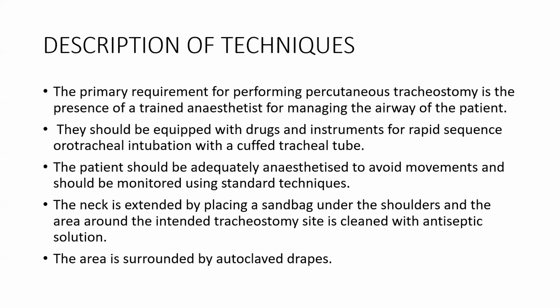Now, description of the technique. The primary requirement for performing percutaneous tracheostomy is the presence of a trained anesthetist for managing the airway of the patient. They should be equipped with the drugs and instruments for rapid sequence orotracheal intubation with a cuffed tracheal tube. The patient should be adequately anesthetized to avoid movement and should be monitored with standard monitoring. The neck is extended by placing a sandbag under the shoulders and the area around the intended tracheostomy site is cleaned with antiseptic solution. The area is surrounded by sterile drapes.